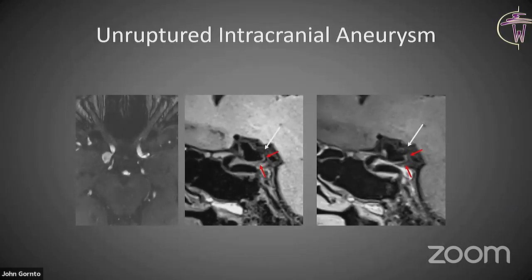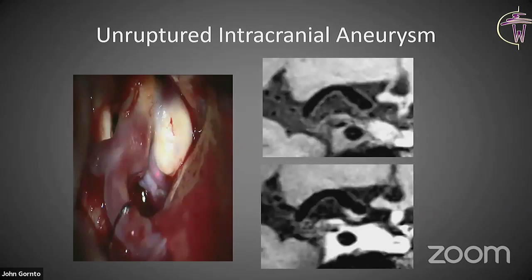Another example, left PCOM aneurysm. You can see thinning along that dome, or along that little nipple of the aneurysm where these arrows are pointing. In addition, vessel wall imaging can help in terms of detection of atherosclerotic plaque associated with aneurysms. And here's an example with an eccentric lesion along the parent artery that's enhancing. You can see that enhancement was vasa vasorum involving the parent artery above the aneurysm.